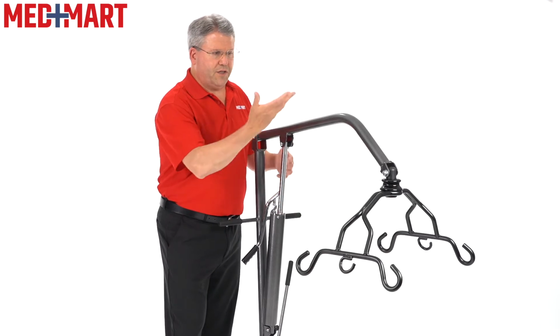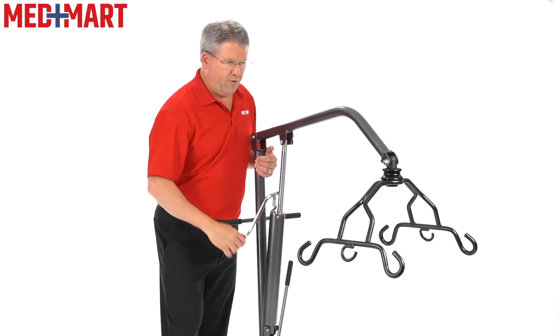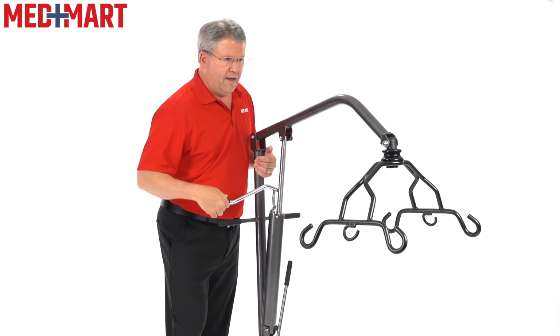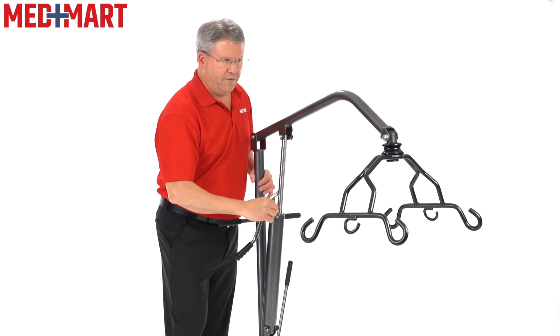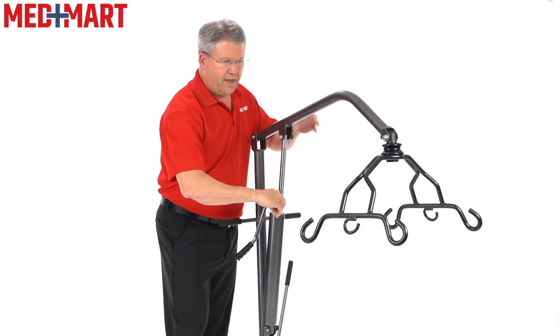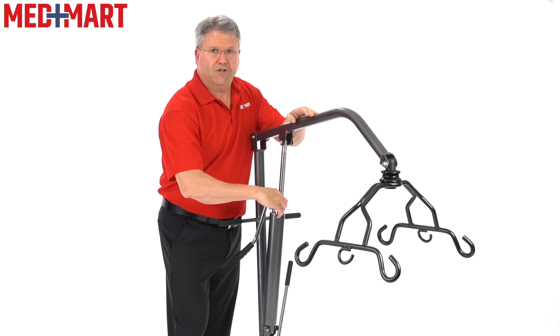So in order to be able to adjust the arm of the patient lift, basically it's a very simple hydraulic pump. So by cranking this down in increments, it gives me the lift that I need for the patient. And simply a little valve here that I have to just slowly turn. When the weight's on there, it will bring the patient down gently.